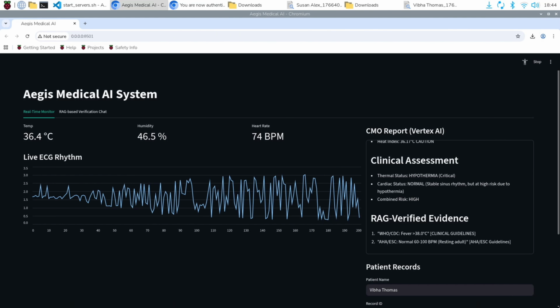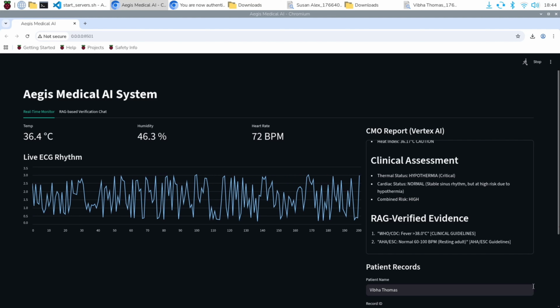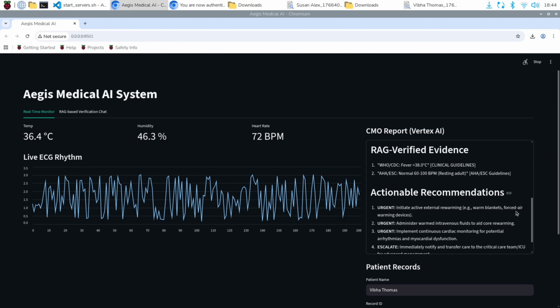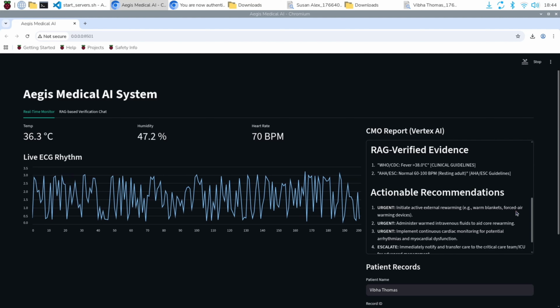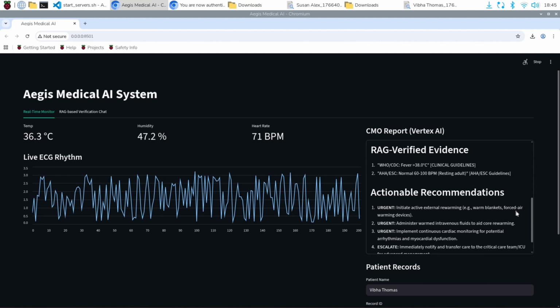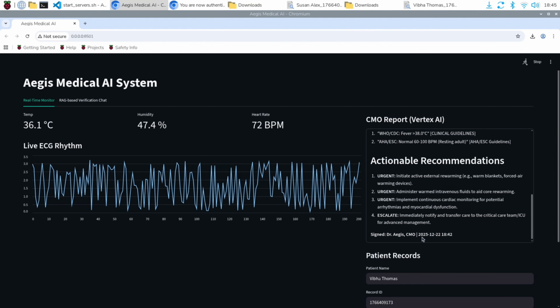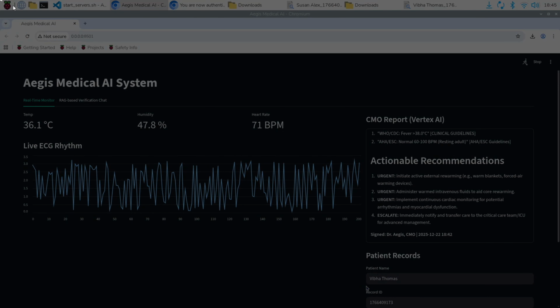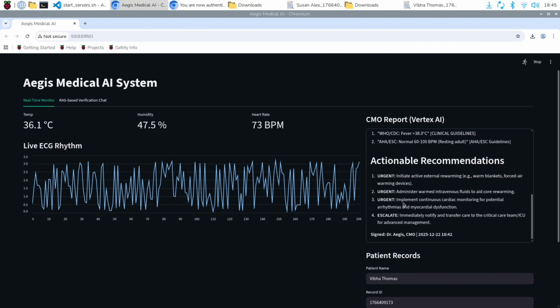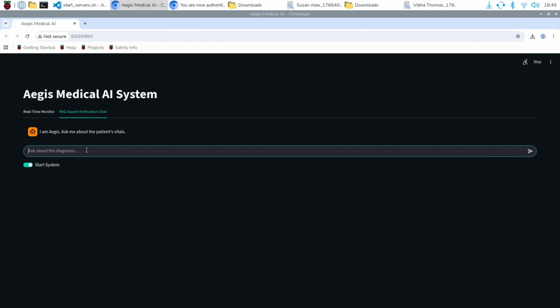And now when you notice, the graph is very, very spiked up. That's because I'm trying to take a screenshot, and there's a lot of movement in my body, that's why it's fluctuating a lot. But I've removed all that noise, and that's how the beats per minute reading, that's the heart rate, is capturing only the vital data, that is the heart rate.